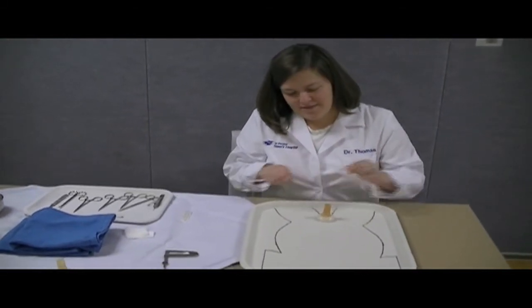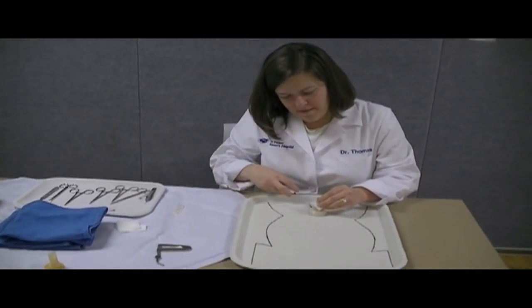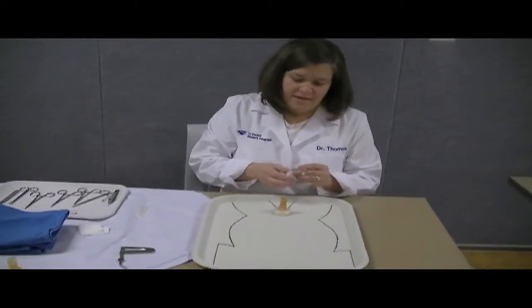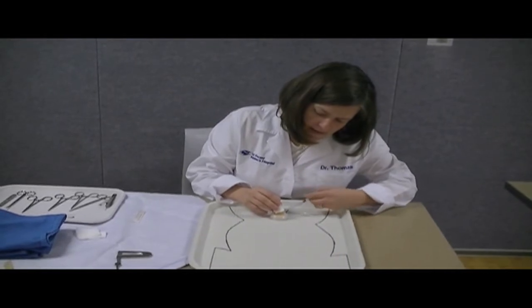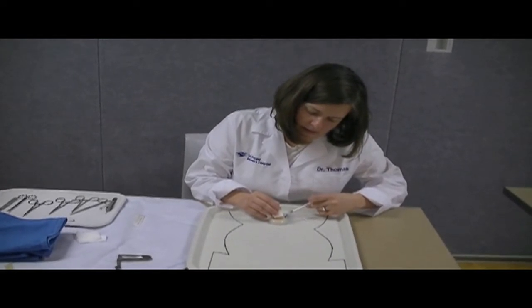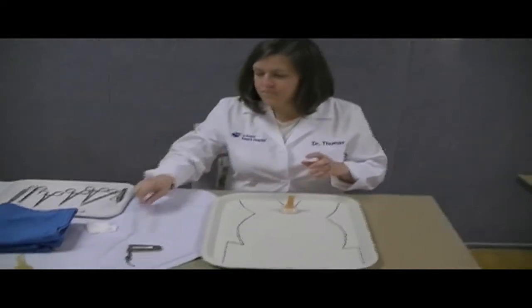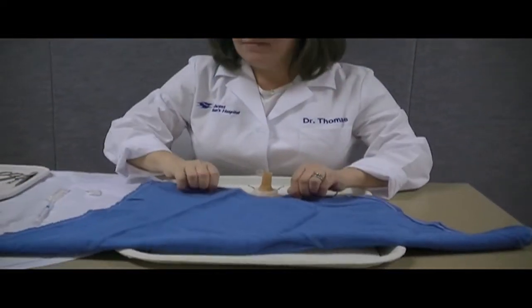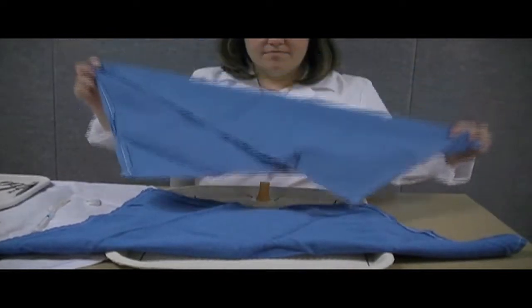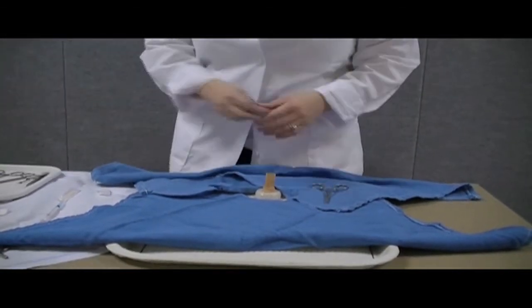We will now demonstrate the use of the circumcision model using the Mogan clamp. The learner initially anesthetizes the penis using a dorsal penile block by simulating giving 1% lidocaine, 0.5 cc's on both sides at both 10 and 2 o'clock. Now, after sterile preparation, sterile towels will be placed over the simulation model. All steps of the simulation are performed in sequence.